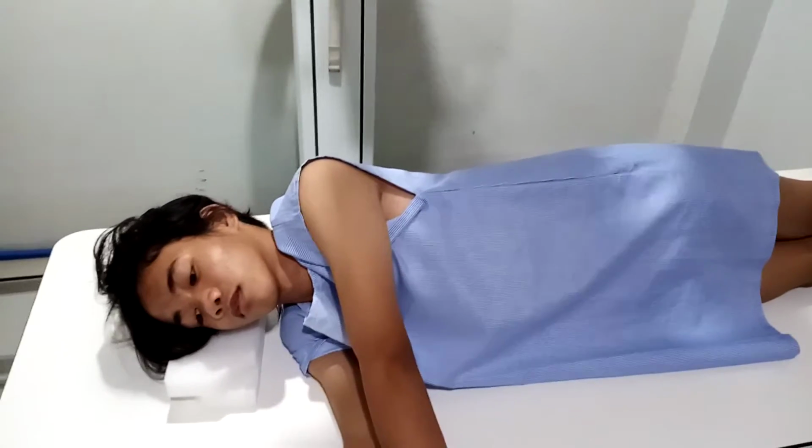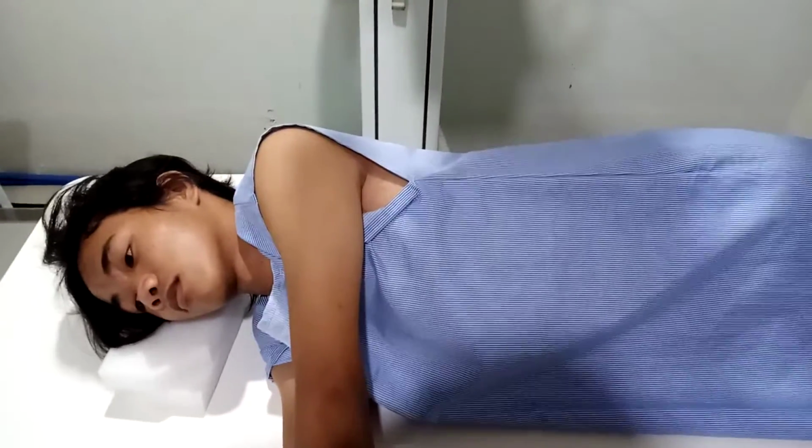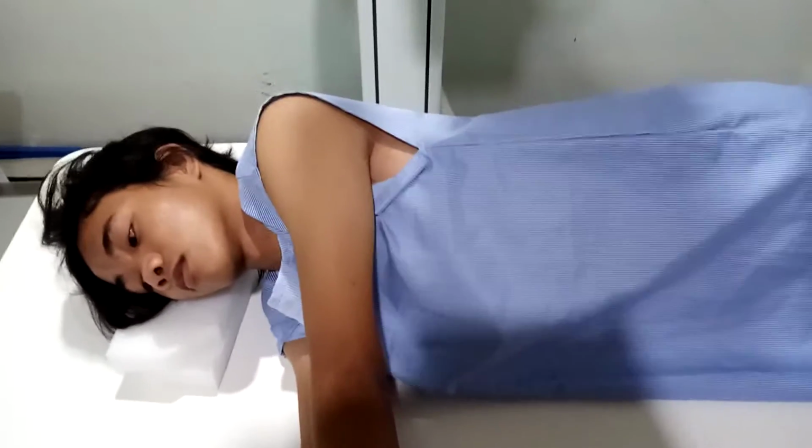Place support under the lower thoracic region until the spine is horizontal to the tabletop. Then always remember to shield again the gonads.